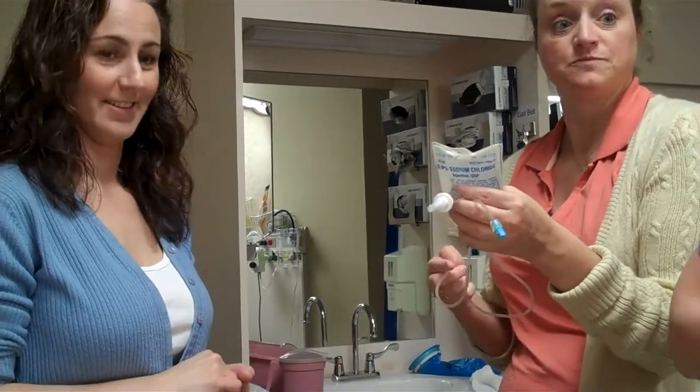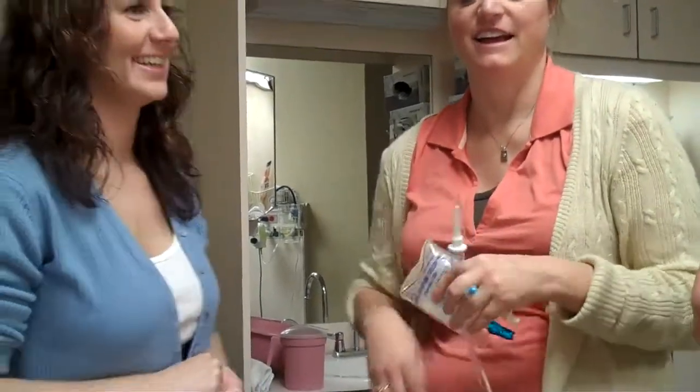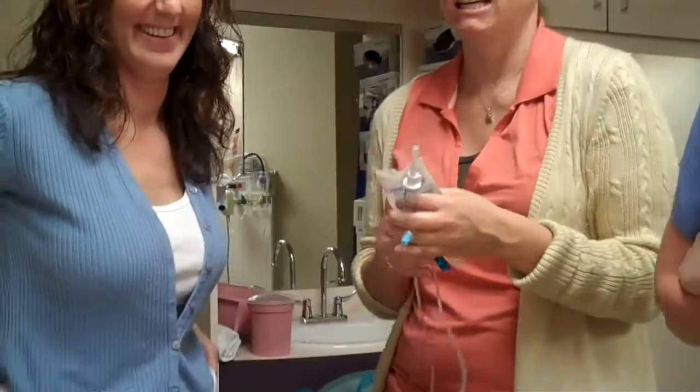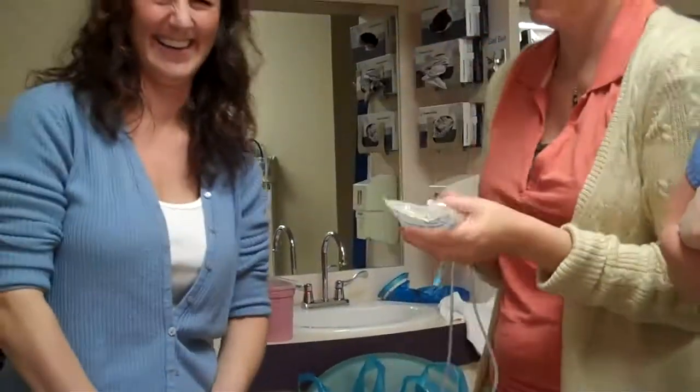And then we got to show her how to flush. Now we're gonna flush after every infusion. Are you okay with me doing this? Yeah, I'm fine with you doing it. Oh God, it's not that bad. Your life really is in my hands now. By the way, this helps having video, because if you have any questions, we can always go back to the video and say, okay, you were supposed to do this.